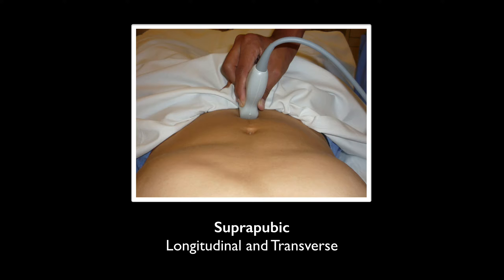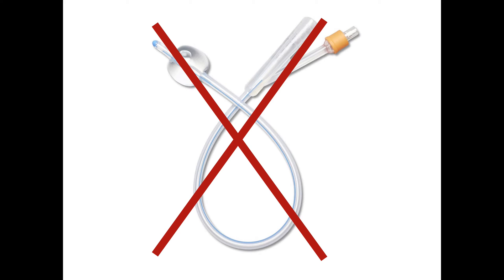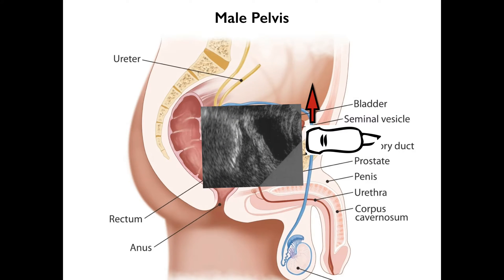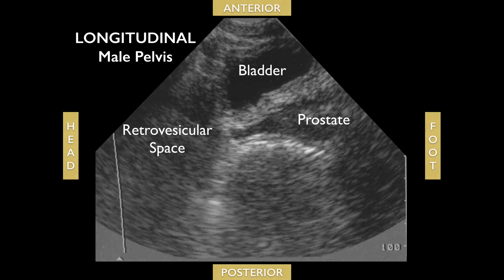For the pelvic view, go to the suprapubic area in either longitudinal or transverse views, with indicators towards the head and the right respectively. Make sure the patient has a full bladder and try to perform the exam before placing a Foley to ensure a good acoustic window. For a male pelvis, the two structures to identify are the bladder and the prostate.